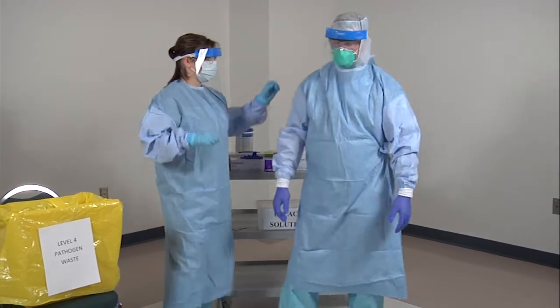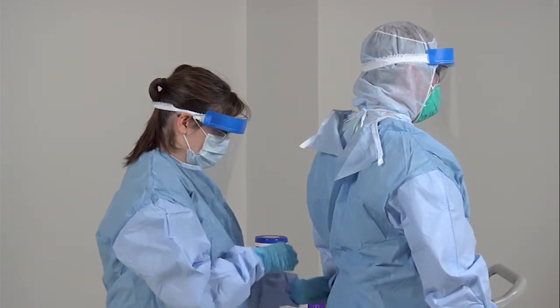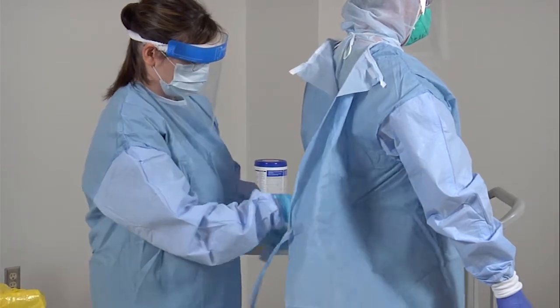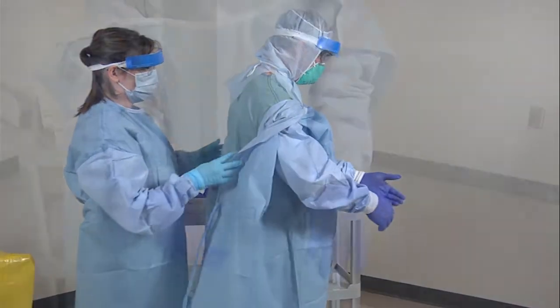The quality monitor will assist with removing your gown. They will untie the top tie first, then the outside waist tie, and then the inside waist tie. The quality monitor will then fold the gown downward off your shoulders.